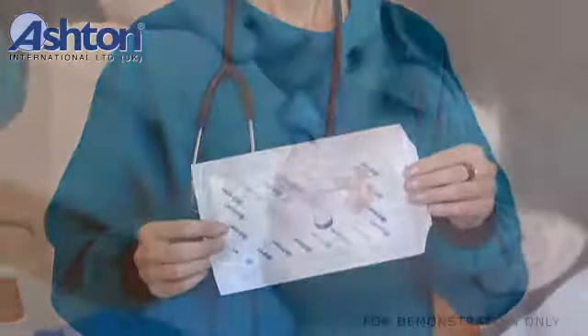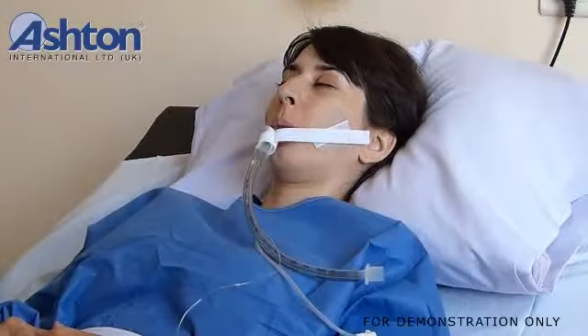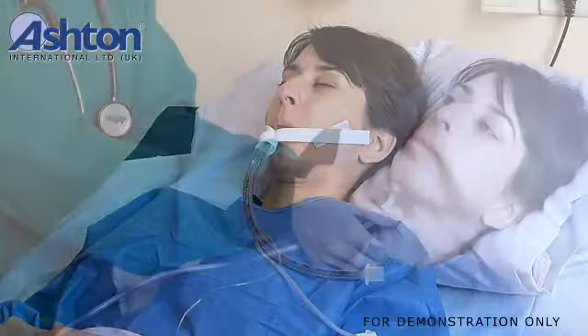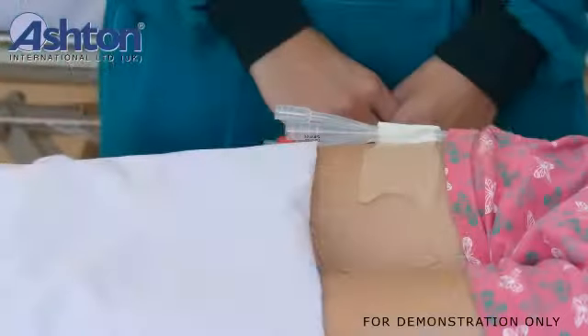AshFix Tube Attachment Support allows a wide range of attachment of fixing tubes, catheters, and hoses to the body. AshFix supports multiple lines of varying sizes, positions and secures tubing and lines, and organizes cords during medical procedures.